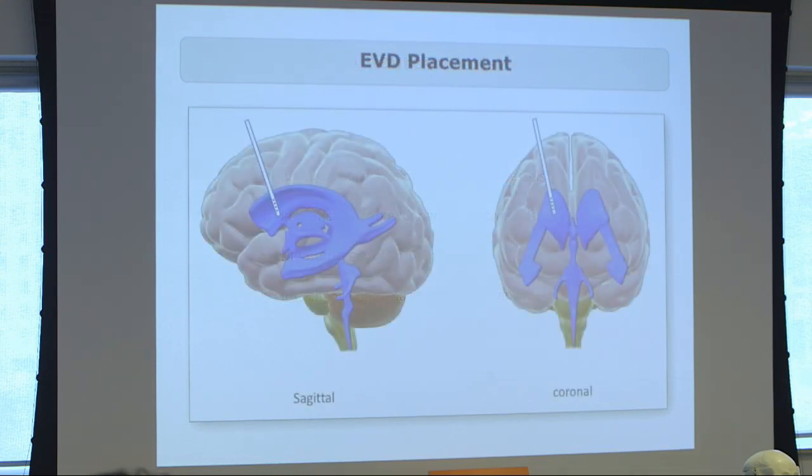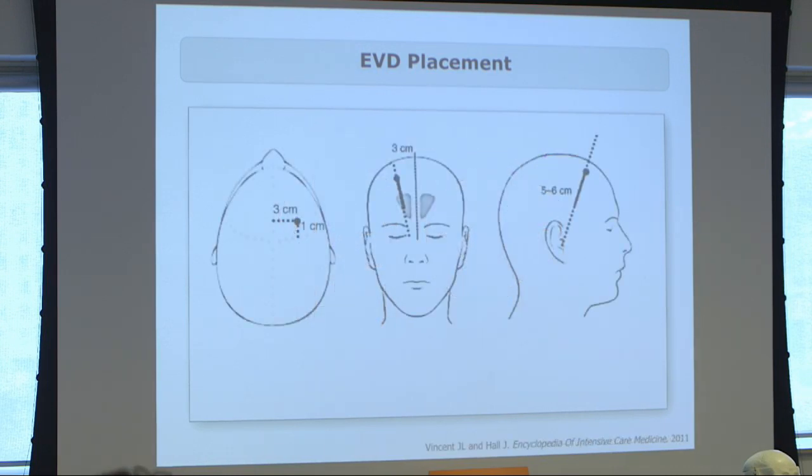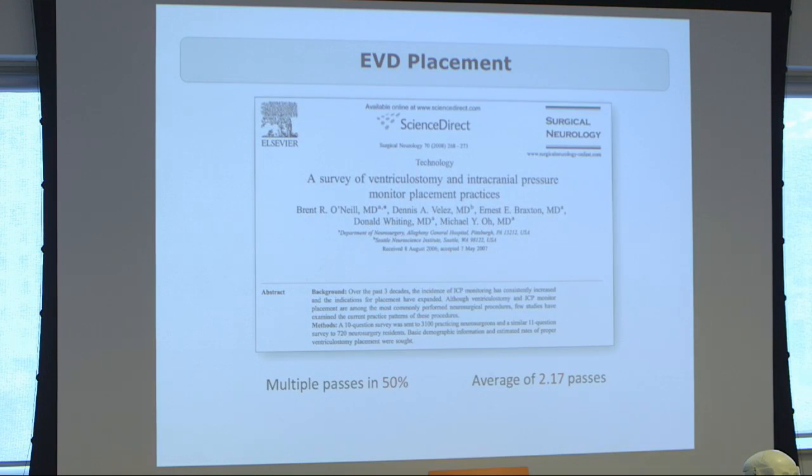Now, when you're placing ventricular catheters, you want it to wind up in the right frontal horn, typically. And in emergency situations, it's got to be quick, it's got to be reliable, and we commonly use anatomical reference points on the skull, and then we have a few numbers with which we can make things a bit more definite. But you'd be surprised where these catheters can wind up.